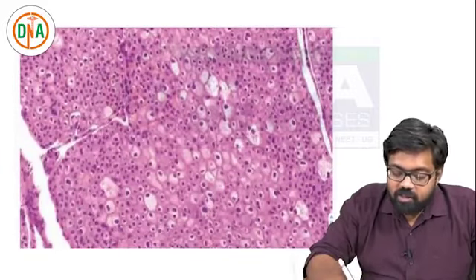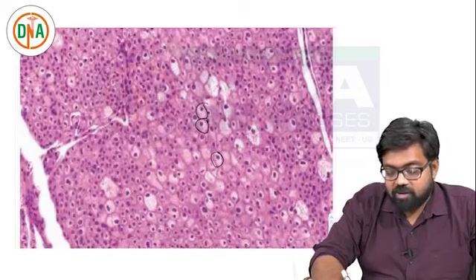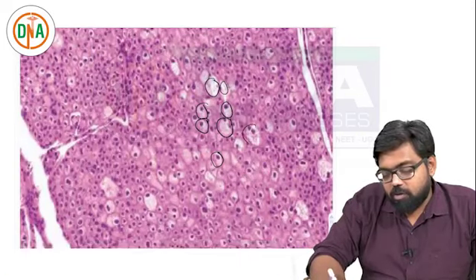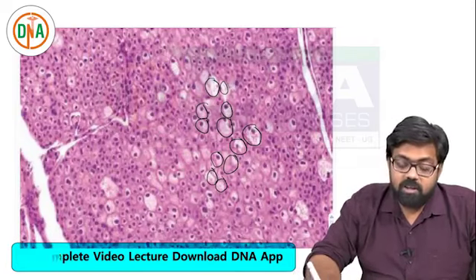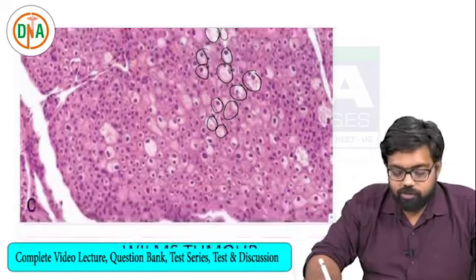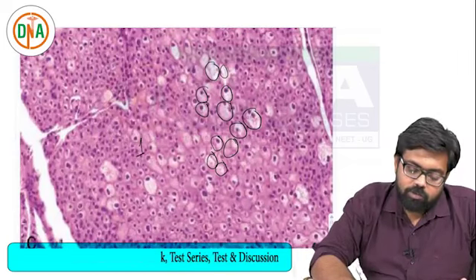And next, very evidently you can make out this perinuclear halo, which is characteristic of this chromophobe variant. Chromophobe variant is also associated with a familial syndrome called Birt-Hogg-Dubé syndrome, which we already discussed much earlier. This is the plant cell appearance, perinuclear halo, very good prognosis among all, and it also deals with chromosome 1 and chromosome Y loss.